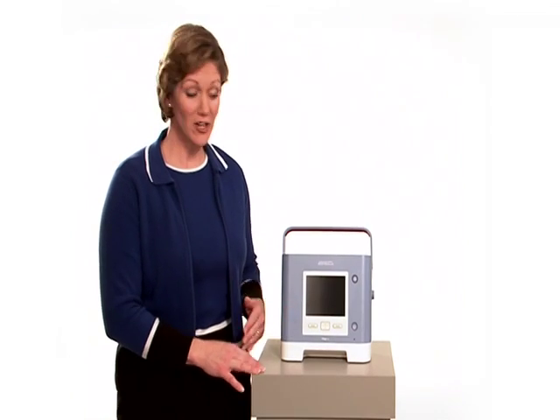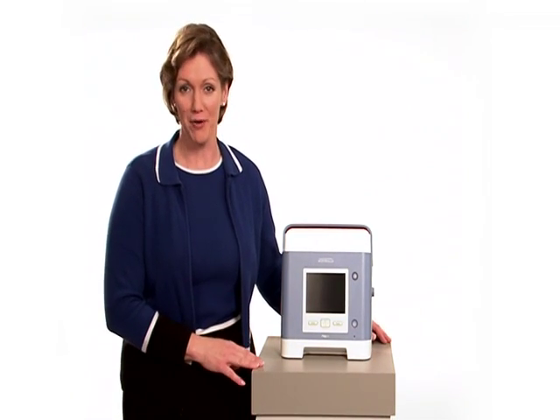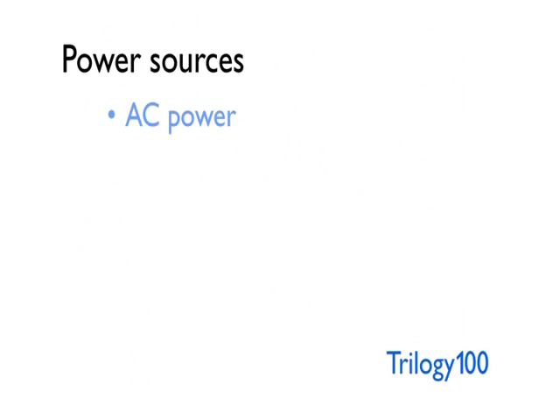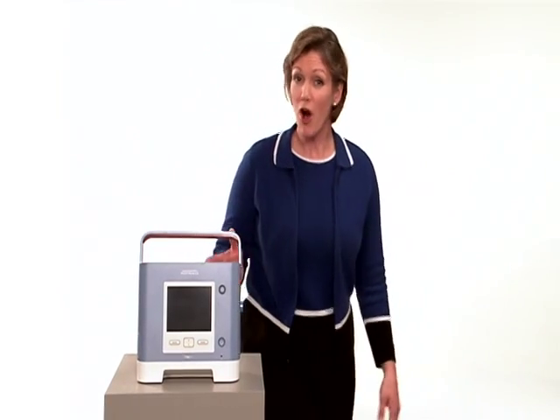Once Trilogy100 is on a solid surface, you can start the setup by providing power. Trilogy can be powered by 4 different sources: AC power, an external battery, a detachable battery pack, and an internal battery. The device will always use AC power if available.